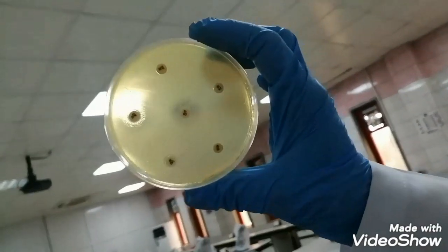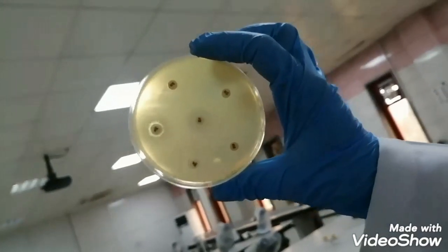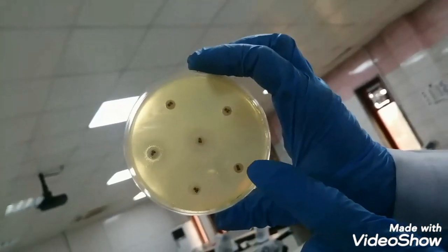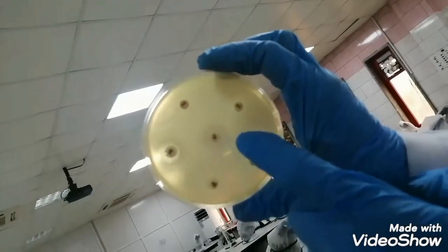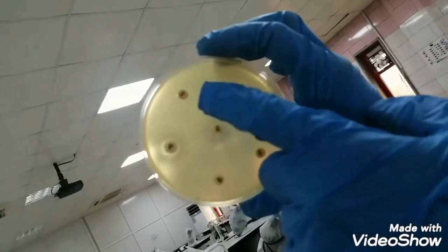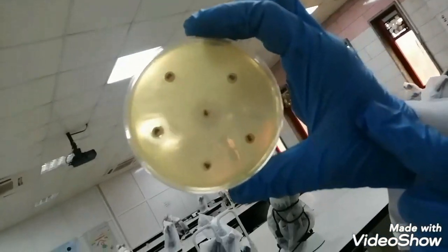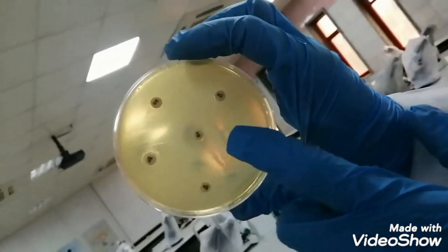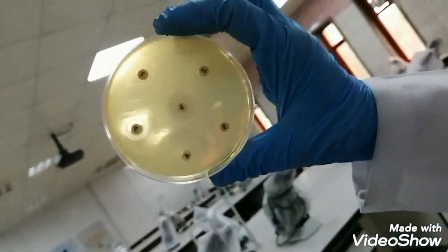After 24 hours of incubation, we see that some of the discs are surrounded with a clear zone, others are not. This disc, for example, is surrounded with a clear zone. This disc is smaller. This is without any clear zone around it. If there is a clear zone, it means the microorganism is sensitive to that antibiotic. But if there is no clear zone around the antibiotic disc, the microorganism is resistant to the antibiotic. According to the diameter of the clear zone around the antibiotic disc, we can know how sensitive or resistant the microorganism is to that antibiotic.